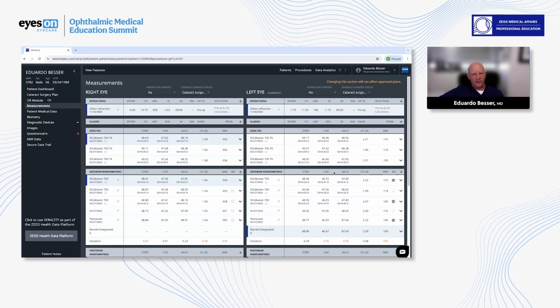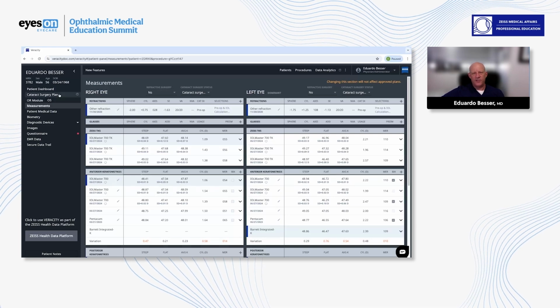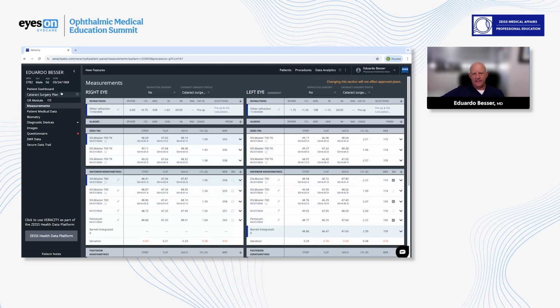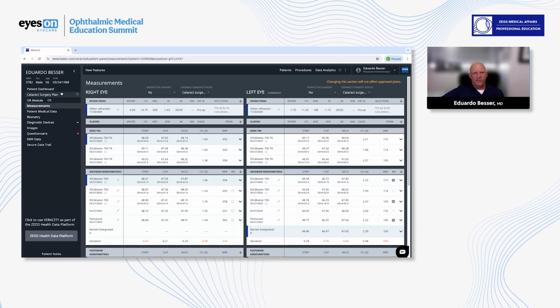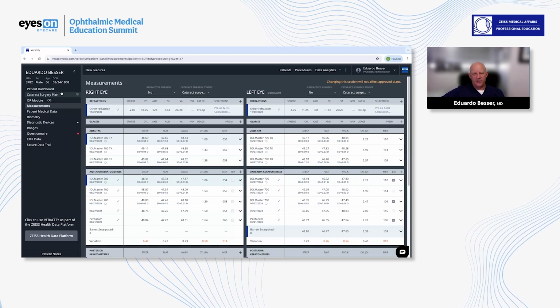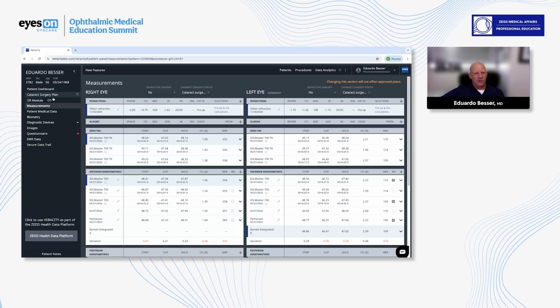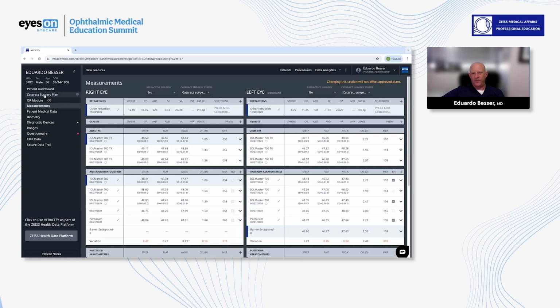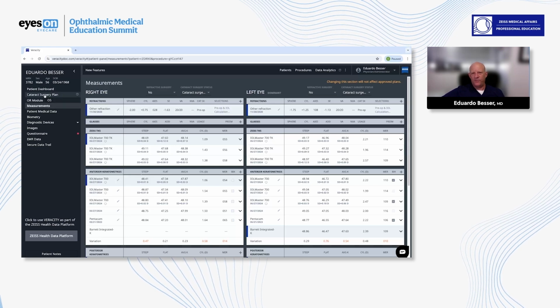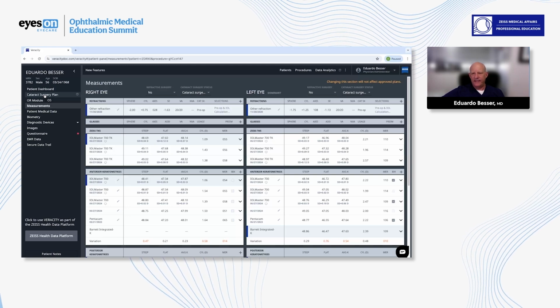And so this has really made surgical planning for me much, much more efficient, much quicker. It has kind of given me the power of not having to depend on my technicians for calculations and to adjust different lenses. And I really enjoyed being able to use multiple formulas and determine which formula is best so easily and on the fly.